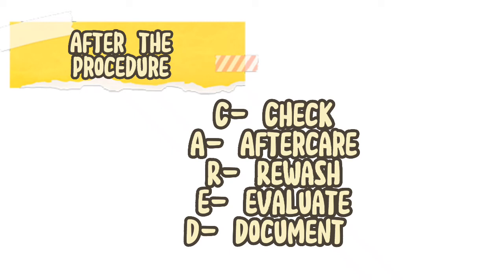Report any significant deviations from normal to the primary care practitioner. Note use of appropriate safety measures, transfer belt, locking wheels of bed and stretcher by UAP during transfer process. D. Document. Document that procedure was done and all relevant information.